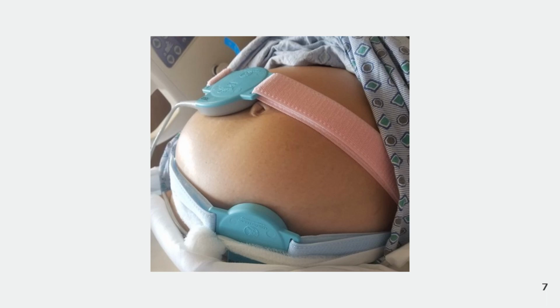And again, this one is just showing you placement of the monitors. Okay, so up top there you have your TOCO, measures contractions. Below you have your fetal heart rate monitor, which is measuring the fetal heart rate.